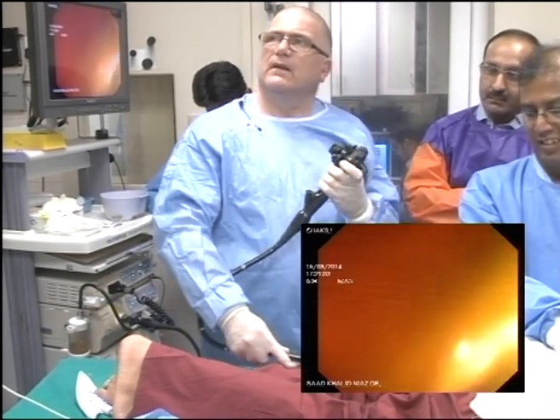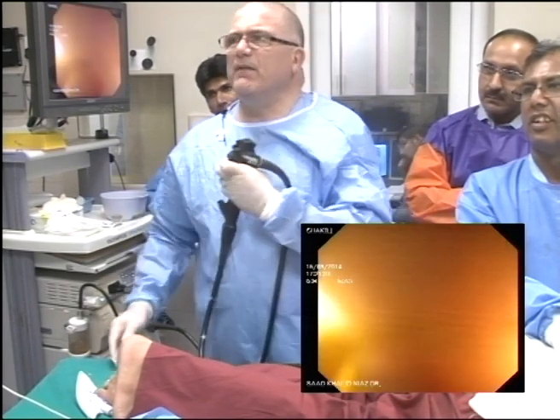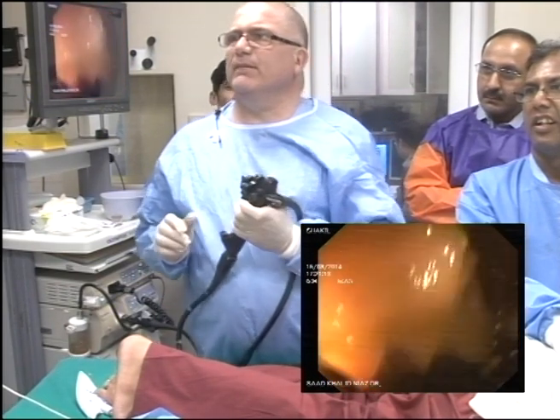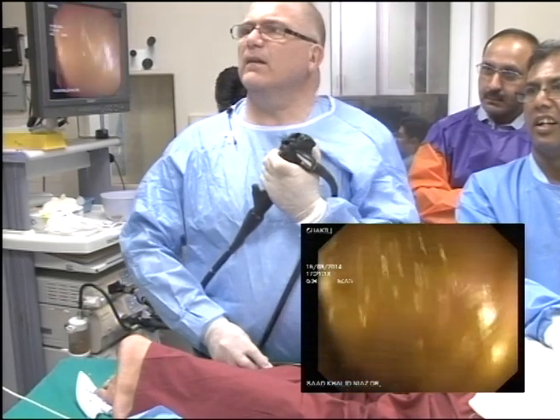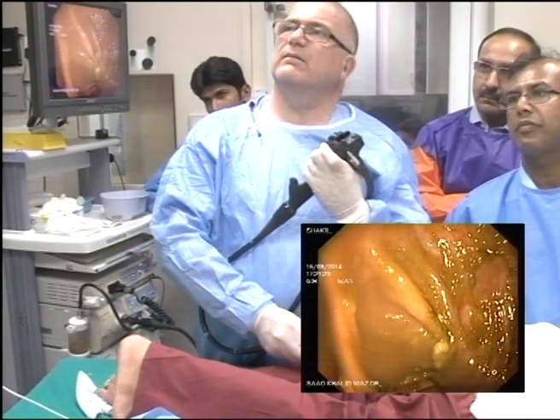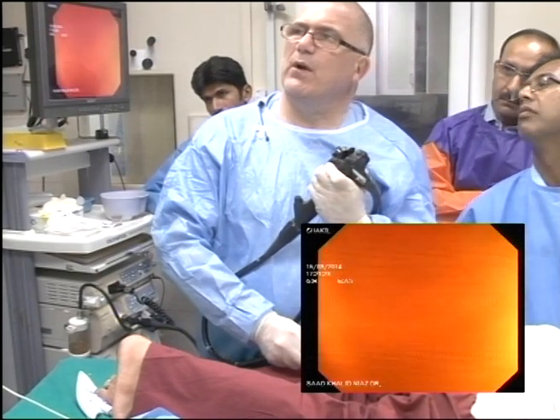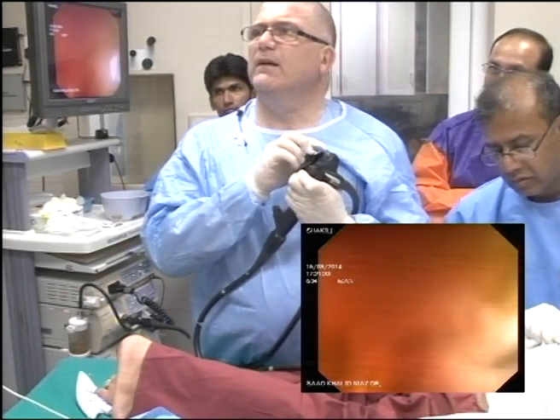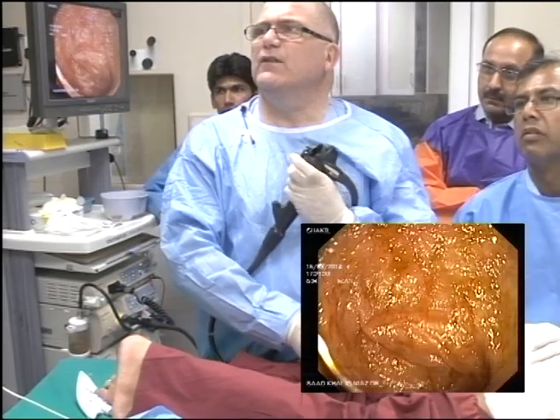Yeah, we saw that. As you come back, you just draw the scope back, big wheel back, a little bit of air, and then the scope will sit on the mouth of the TI, hopefully go in. And sometimes you just miss it. I tend to now blow water. Just back there with the little wheel back. And there she blows. So blow water helps the scope straight in.